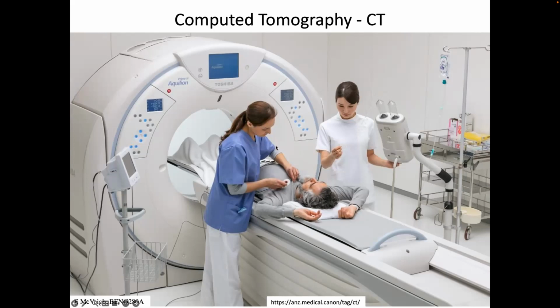So here's the imaging device. We've looked at it before. There's about a 50 centimeter diameter volume in there that will cast an X-ray shadow on the detector. There's a highly controllable table that is accurate to within, say, 1/4 millimeter or so. And so you can move that table back and forth to position somebody inside your beam.